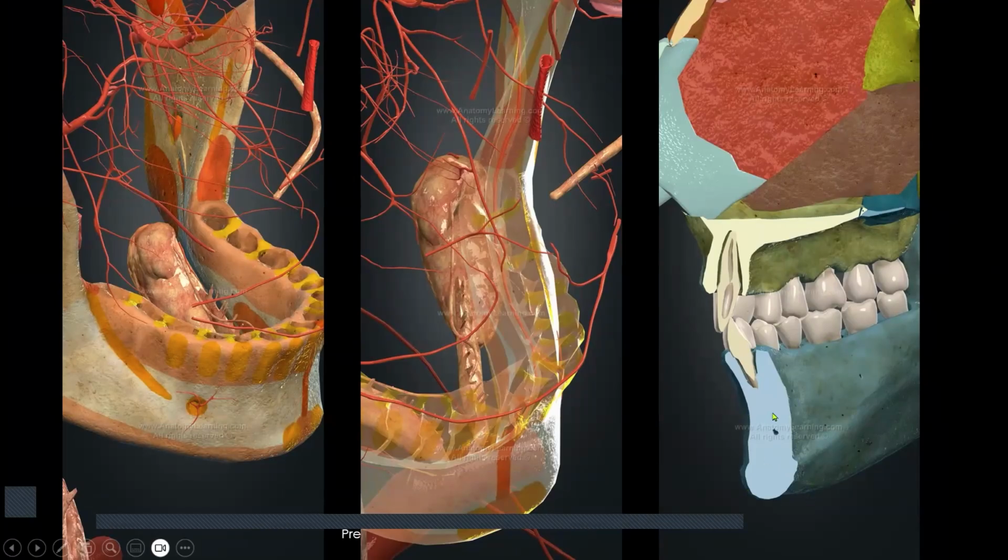So in the mandible anterior region, it is important that your implant is below the tooth root, 3 to 4 millimeters below the tooth root. That is all your basal or cortical bone only. The whole bone is your cortical bone. And how do we determine in which area we have to place the implant in the mandible anterior region?